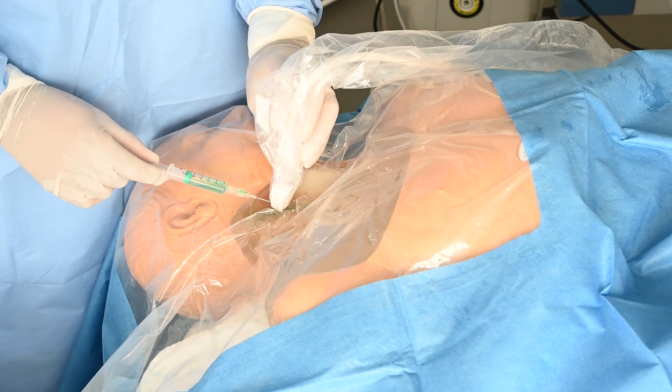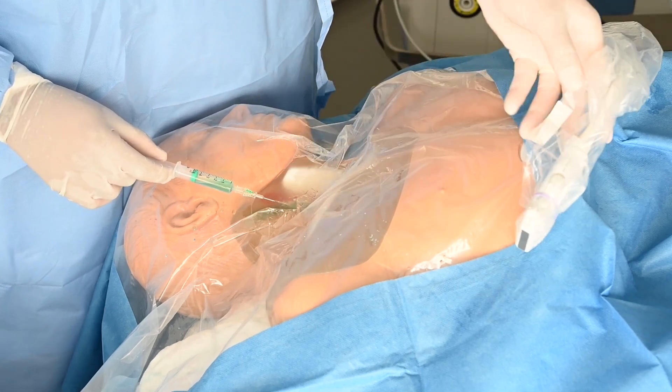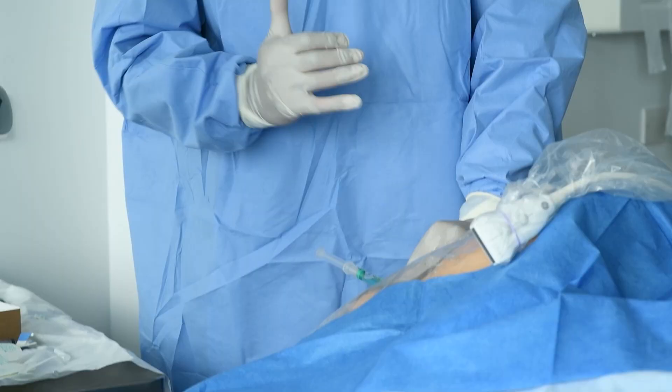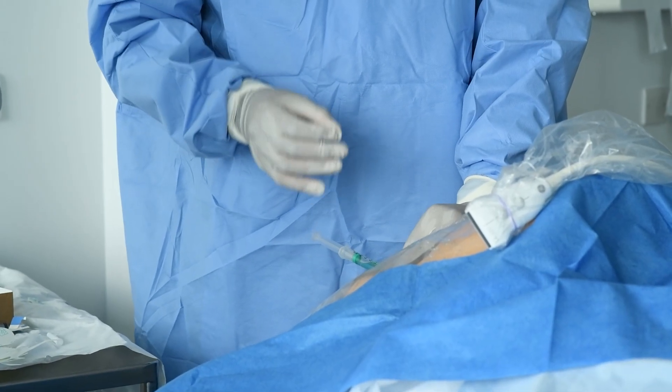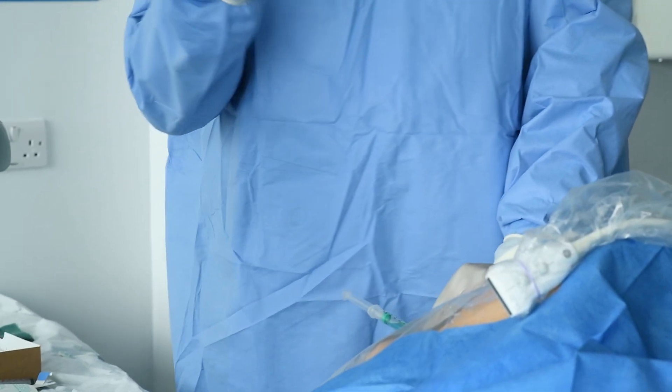So you've done all your hard work, you're in the vessel, you can see it on your ultrasound machine, you've got blood back in your syringe. Now what are you going to do? You normally start off in this position, you're going to drop the probe immediately and then you're going to anchor — holding your needle tip in position so that you can disconnect the syringe and then start threading your guide wire.